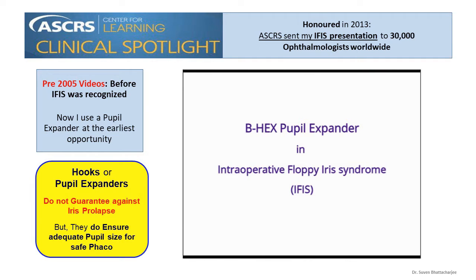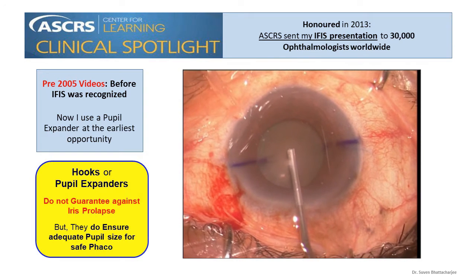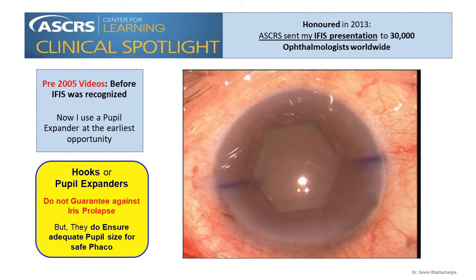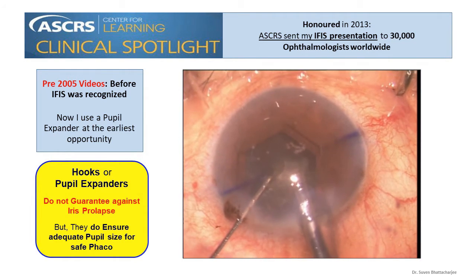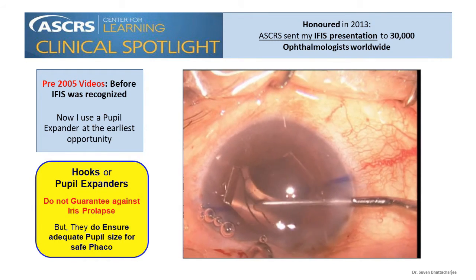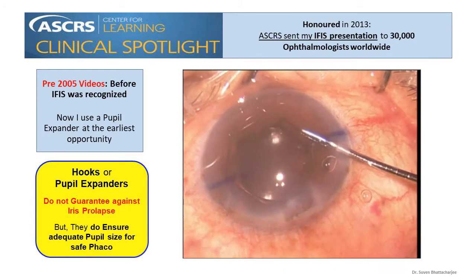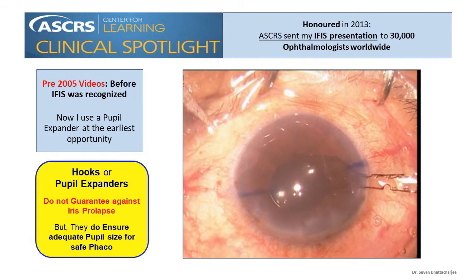This is a short eye with a shallow AC planned for a toric IOL. As soon as I inject viscoelastic, I note a brisk flopping. So I choose to use a BHEX pupil expander, but the IFIS is so overwhelming that I have iris prolapse to the side port as well as the main incision. Nevertheless, I managed to put in an IOL and align it. The BHEX can be removed through a 1 mm side port, and that's a huge advantage in an IFIS situation like this.